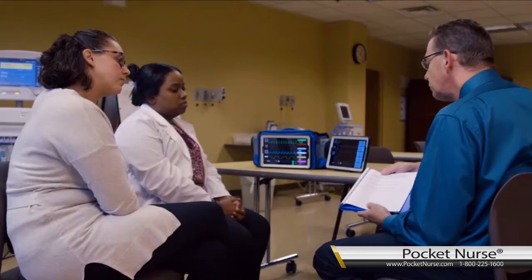Hi, my name is Mike Hyland, and I'm the author of the VentiSIM scenarios. We develop these scenarios to put the student in real-life situations so that they have to make decisions on patients on the ventilator, and then they get to see the effects of their decision. The patient may improve if they make the right decision, or they may make an intermediate choice where the patient is safe but doesn't improve to the level that we want, or they may make an incorrect choice which could be harmful to the patient.